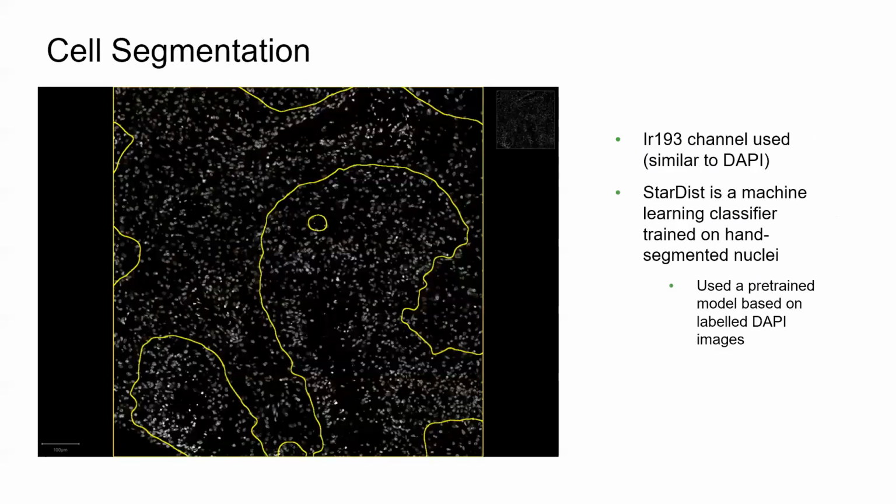Next up, we perform cell segmentation. Now, cell segmentation, much like the pixel classifier, is another tool available in the vanilla or unmodified version of QuPath. However, imaging mass cytometry has a relatively poor spatial resolution of about 1 micrometer per pixel, which is roughly 4 to 5 times lower than that of a 20x fluorescent image. So I'll be using something I partially developed called Universal StarDist for QuPath, which allows us to apply a pre-trained machine learning model to segment this image.